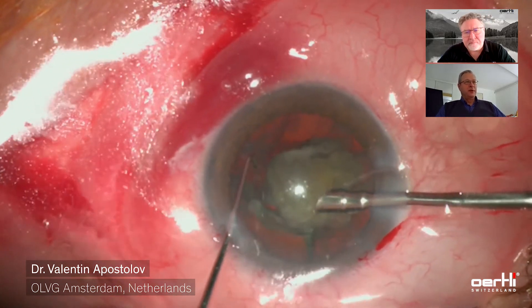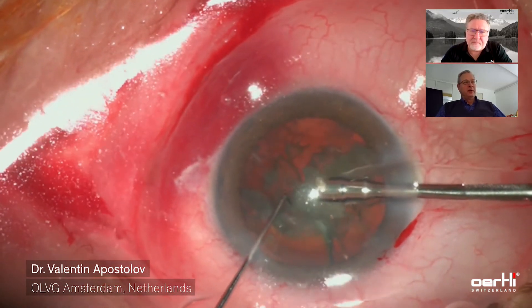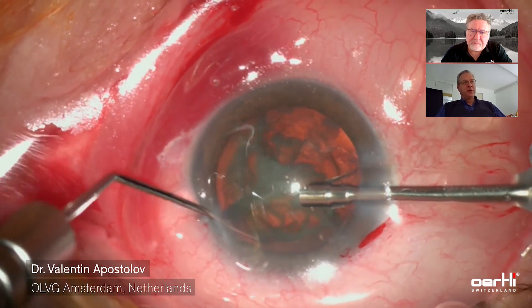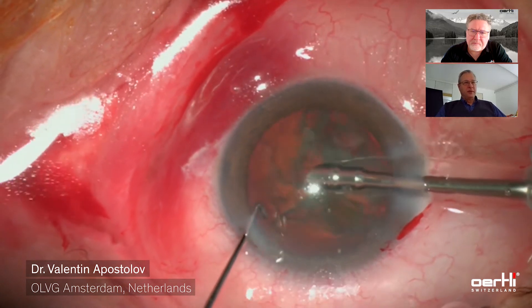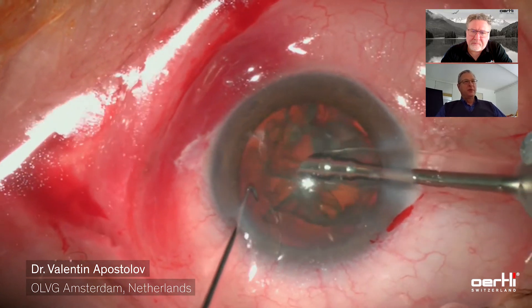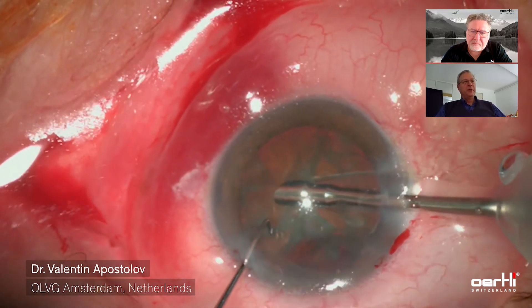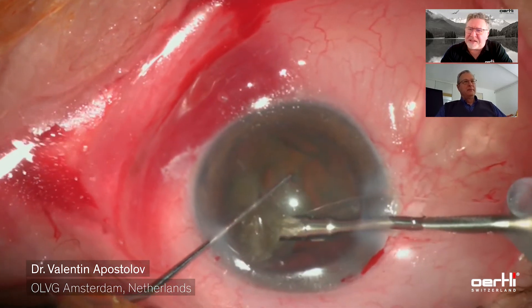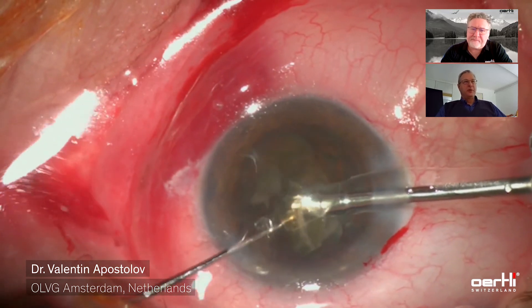One can see here that the anterior chamber remains completely stable as every following quadrant of the nucleus is removed. That has to do with the pump and also with the narrow shaft of the FACO needle. The pump you're using is usually speed mode. Is that correct? Yes, that's the speed mode indeed.